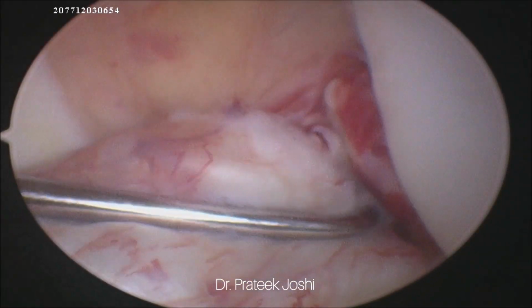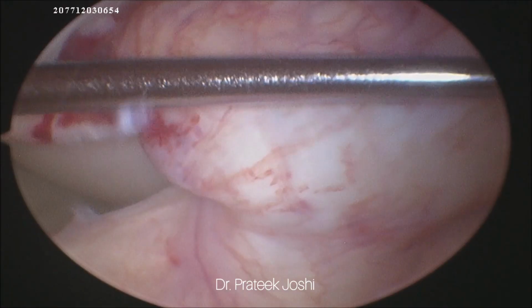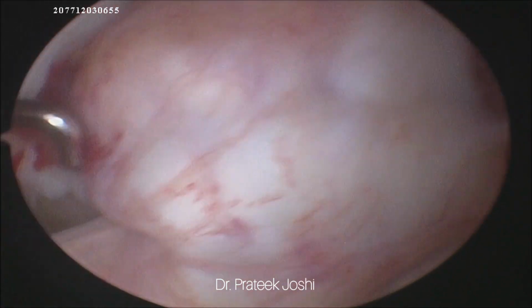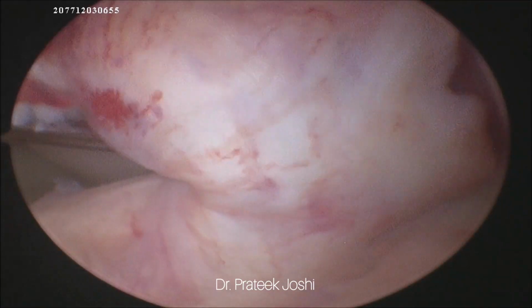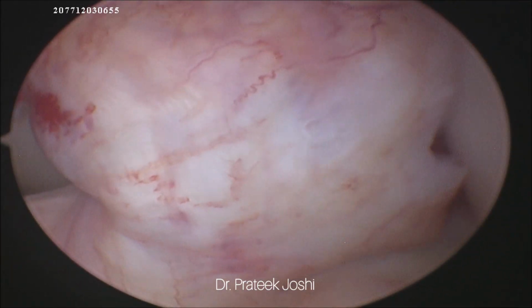Hello everyone, this is a knee joint of a young individual who has twisted his left knee joint and injured his ACL ligament as well as the posterior horn of the lateral meniscus. On diagnostic arthroscopy, you can see that I am seeing from the anterolateral portal and there is complete tear of the ACL ligament from its femoral attachment.